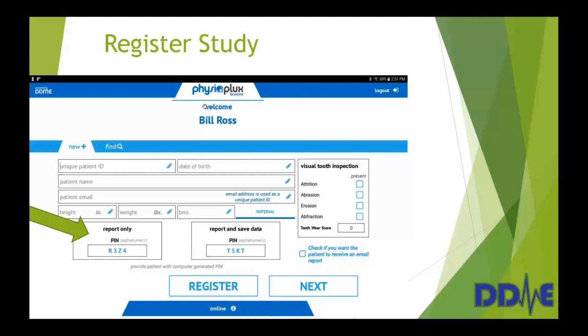When you do your first patient, there will obviously be a different number there. The idea here is this is what the patient uses to log in to the tablet and start their study. So what we recommend you do is fill out an appointment card and put this number on the appointment card and put it in with the GEMPro when you send it home with the patient.